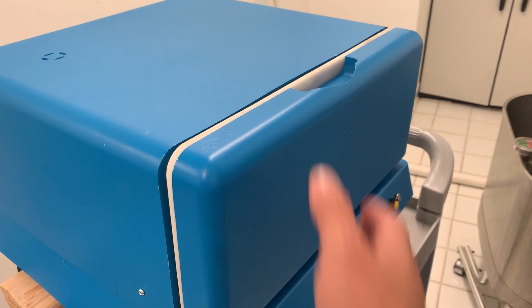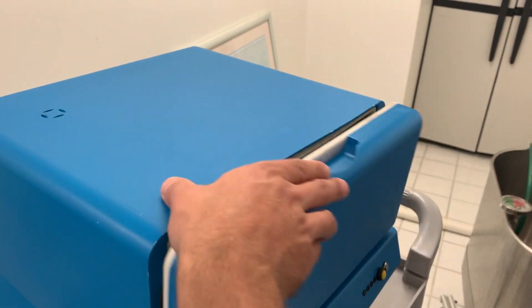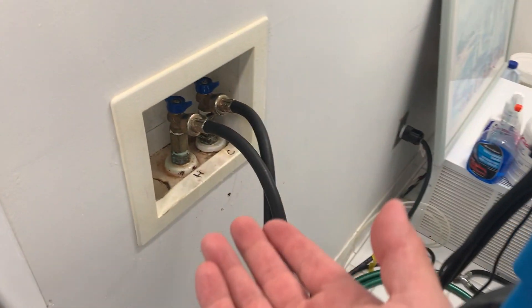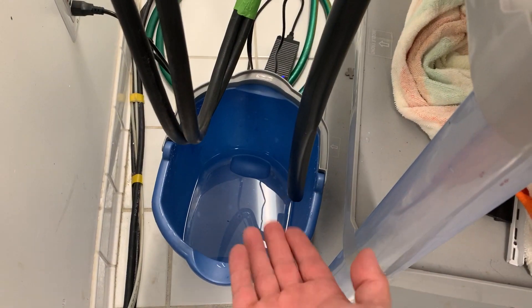Here we have the Ultimate CPAP Cleaner prototype, everything's loaded up as usual. We've got a standard hot and cold water hookup for the purposes of this demonstration, and the exhaust is just going into a bucket.